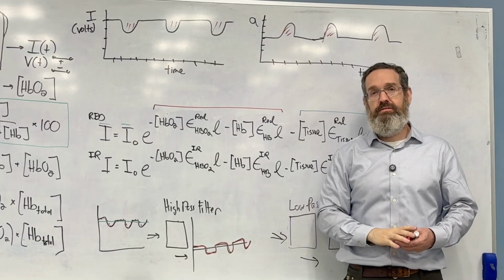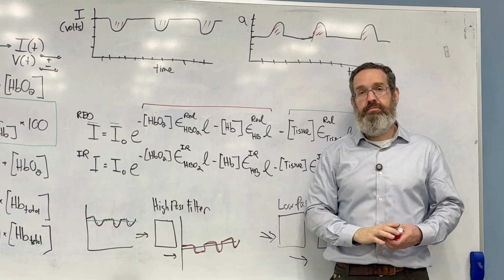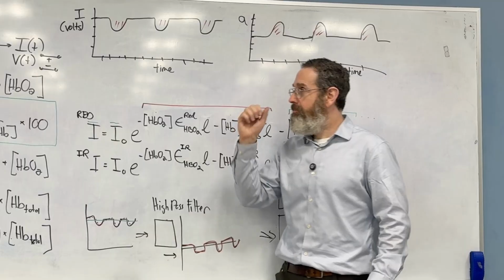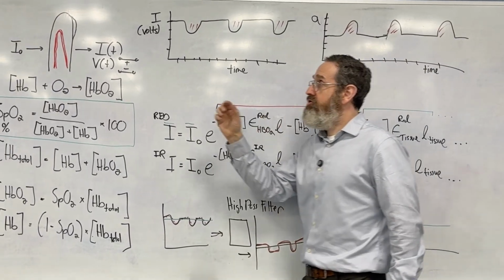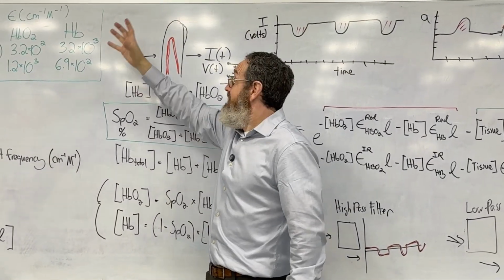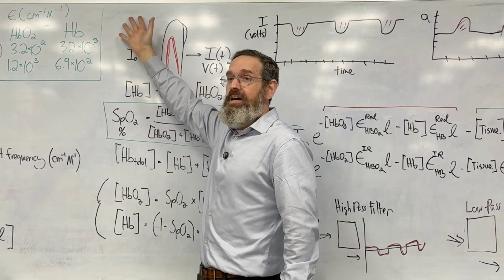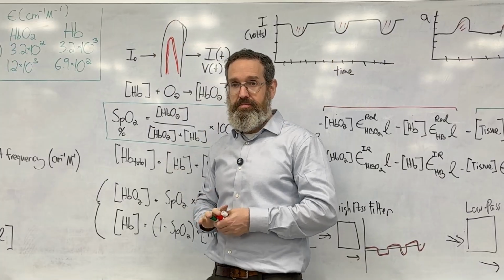Yes? I remember you had mentioned that in the States, because of the power lines, it's almost like 60 hertz. There's also noise on top of it. So it turns out that there's this ambient room light here, and that will be picked up by the sensor, and that will be much bigger than this signal.